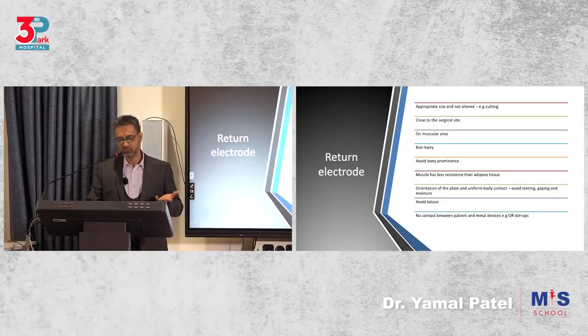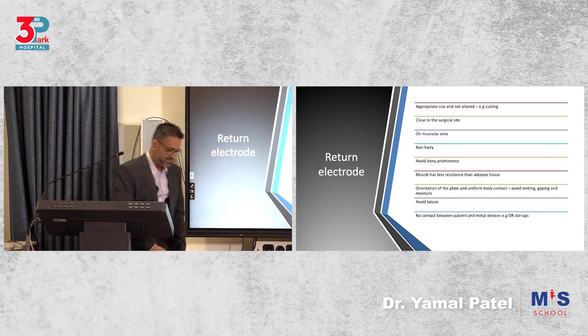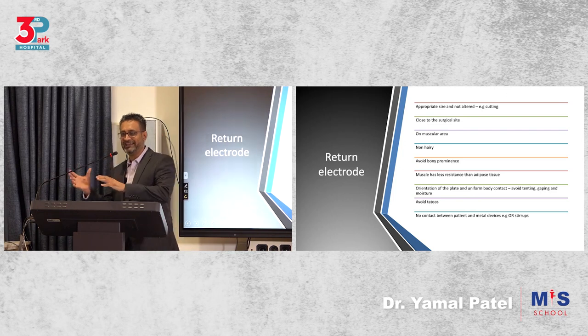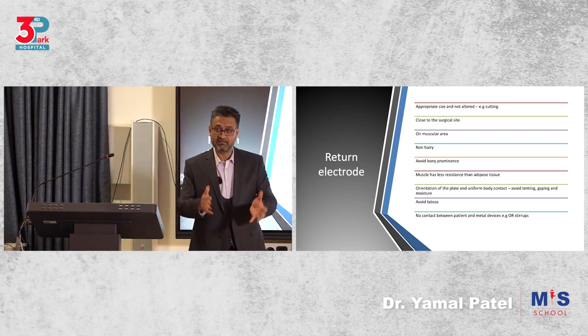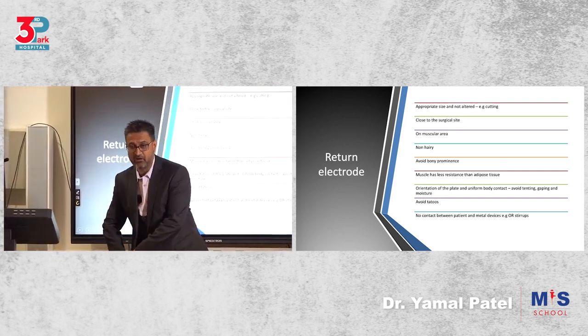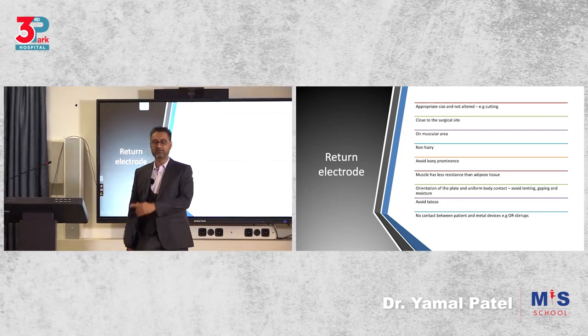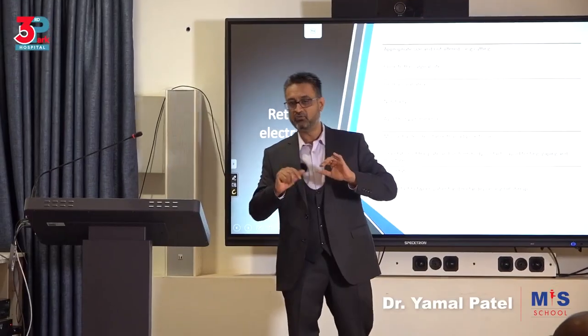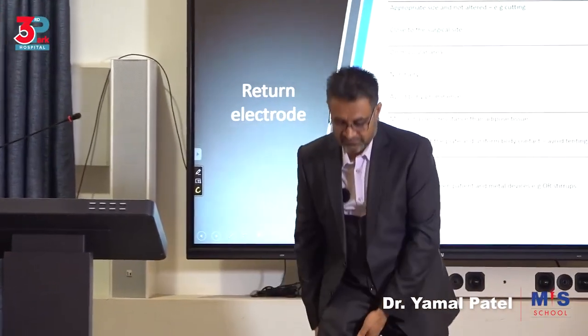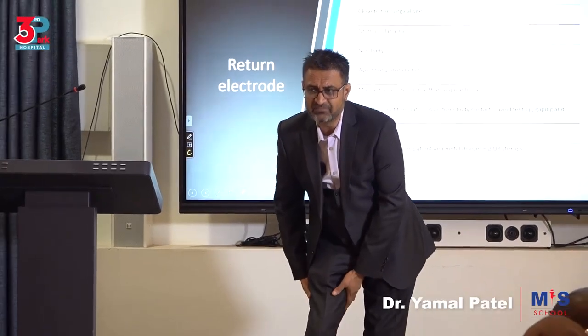Return electrode rules: always use the appropriate size. Don't alter it by saying, oh, it's not fitting, let's cut here and make it fit. No, use the right size, don't change. If you have the black one or the metal one, then you may have to roll it around the patient and then tie around it, whatever. But what I meant was you don't alter the sizes, okay? You maintain enough current.